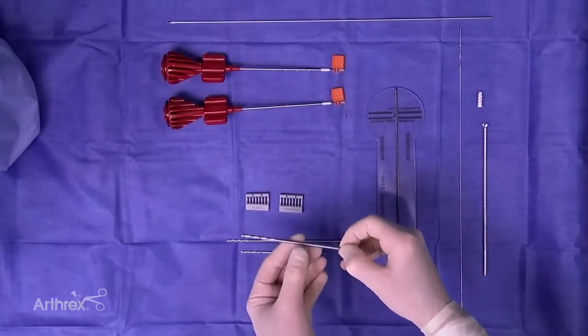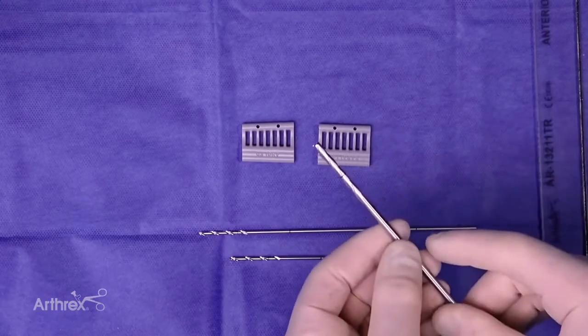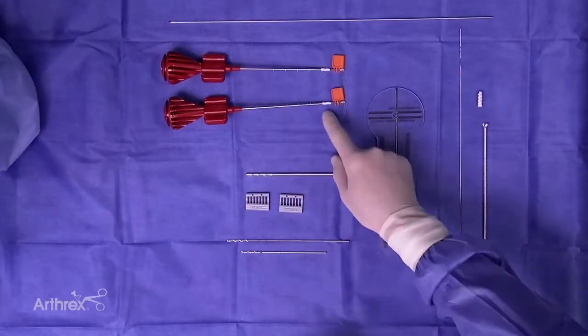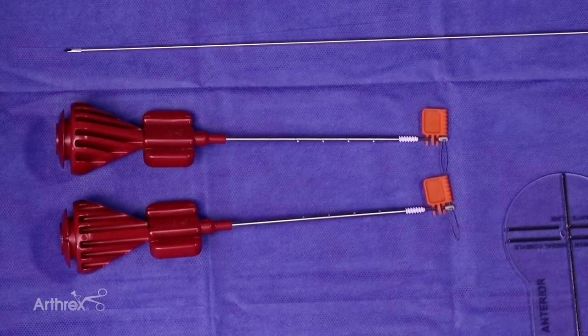For over-drilling on our pins, there's a new drill bit which is 4.0 diameter. It's got the laser line for the depth of drilling so you can see that easily for over your two pins. Then we have the 3.9 Biocomposite Swivlock anchor for our purchase in the patella in our two bone sockets.